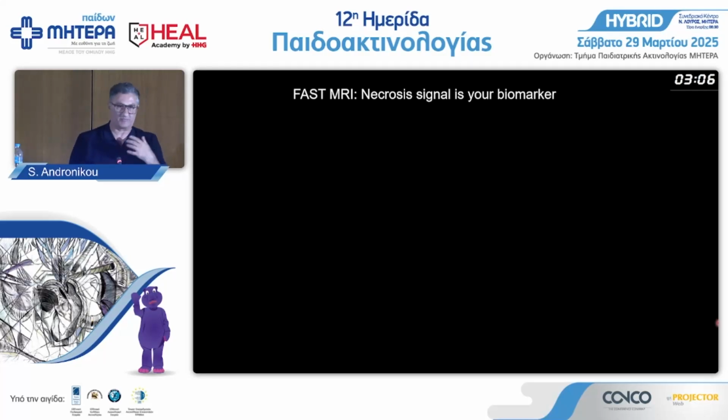Okay. So the next thing I'd recommend, if you have MRI and you're thinking about fast MRI for other things. So I do lots of neuro. I'm thinking about fast MRIs for headaches, whatever, for hydrocephalus follow-up. You limit the time on the scanner. You hope that you do not need anesthesia, and you start to use your MRI scanner for more acute things where they would have had CT and worse imaging, maybe worse imaging, depending on the indication.